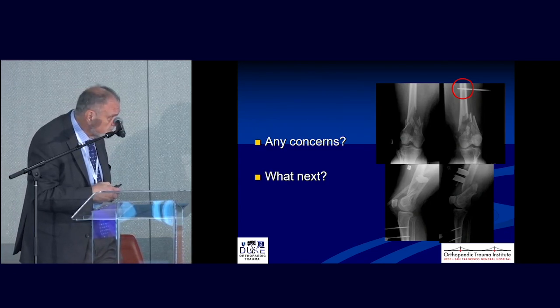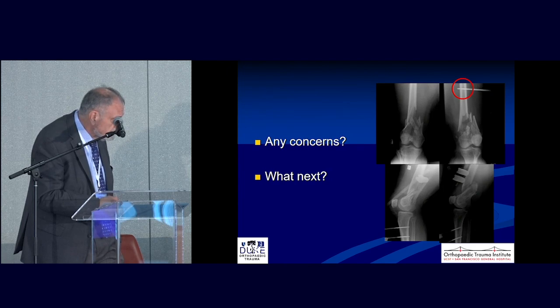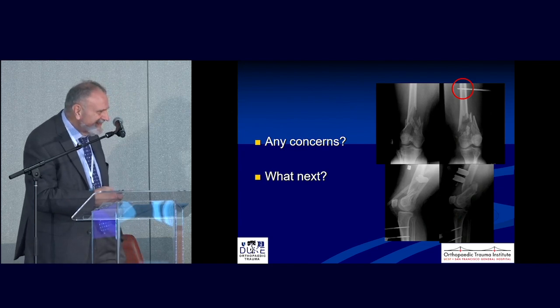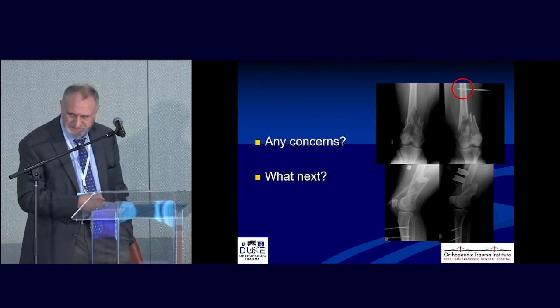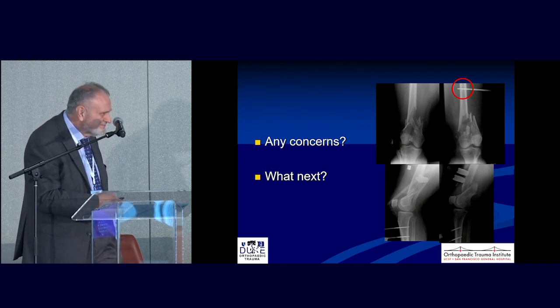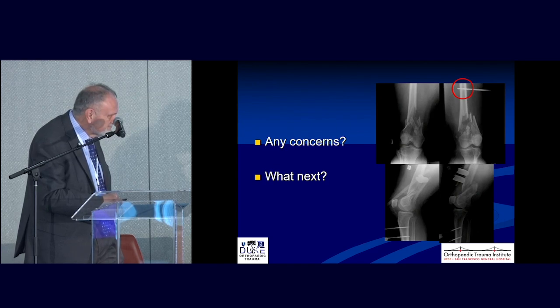I think you get some quadriceps scarring going directly anteriorly, so I kind of go more anteromedially. And then also, it can be close to the artery. Right next to it. But generally, that artery's behind the knee where I'm going to put it, above the knee. But the idea being is that even if I'm plating, it's always a good thing to have something on the medial side, and it just kind of helps me hold the reduction a little bit.